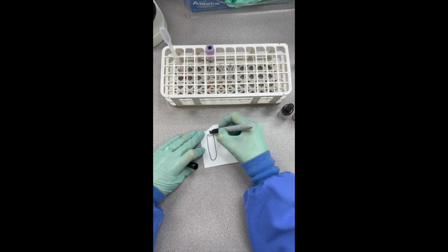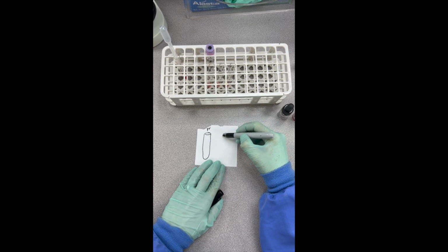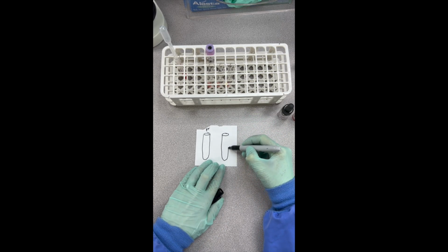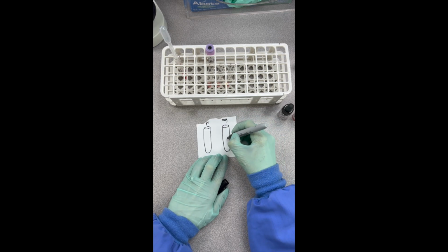Okay, and this right here will be our patient. Okay, and then I'm going to draw a picture so we can compare these of my negative control. So here's my negative control. All right. So in here, we added these cells. Okay. And my negative cells are in here, and we're going to put them in here as negative.